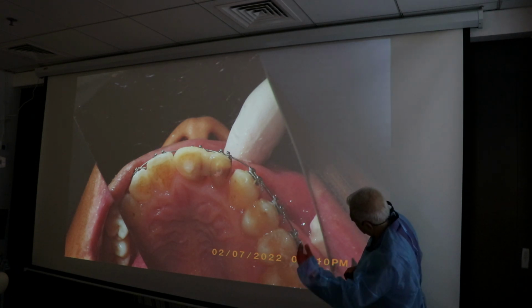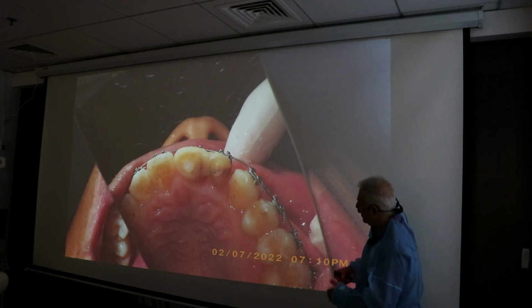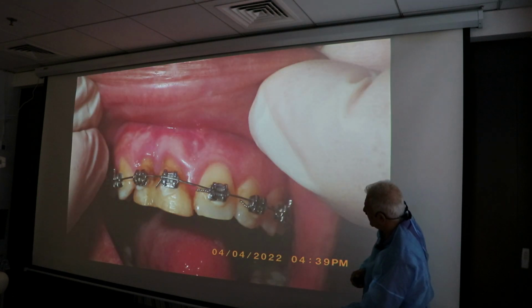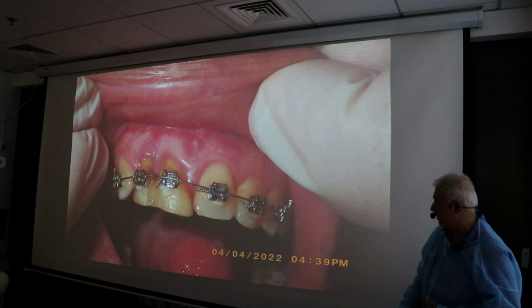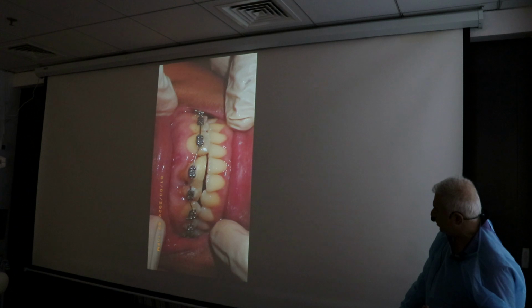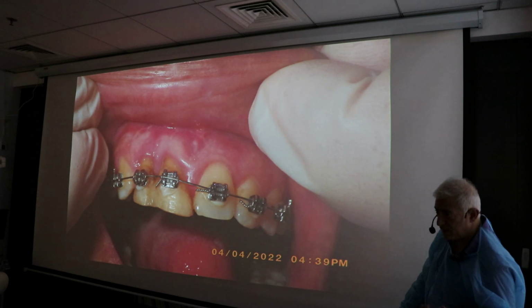And slowly we are cutting the occlusal surface of the teeth as it is coming down, so it will not have contact with the mandibular teeth. And now you can appreciate, you see this? This was way up in the vestibule. Now it is at the CEJ area, this white thick gingiva. Now it's a time to actually appreciate the concept of extrusion from here to that, from here to the last slide I showed you. So this was before and this one is after. Do you see? Okay.